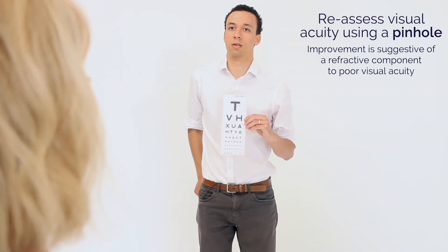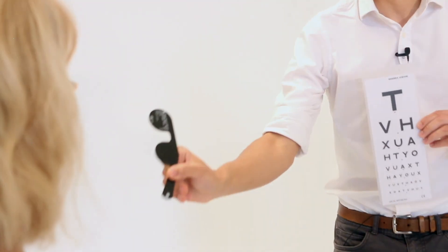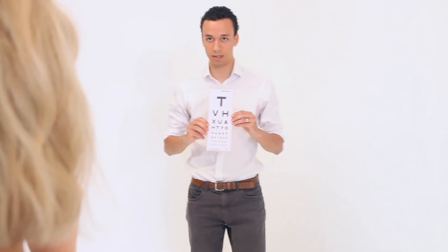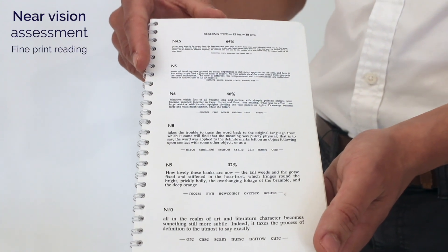That's great. Now if you cover up your left eye again for me please — I've got some little holes here. If you could hold those against your right eye, look through the little holes and see how far down you can read. T, H, A, Y, O, U, X. And that's it.